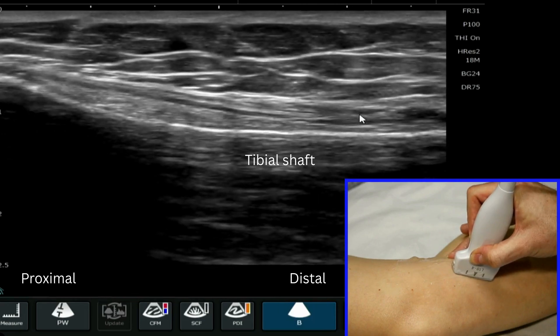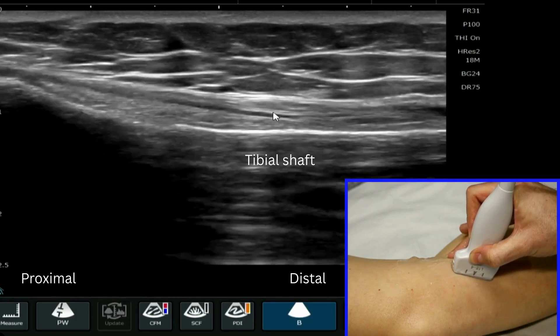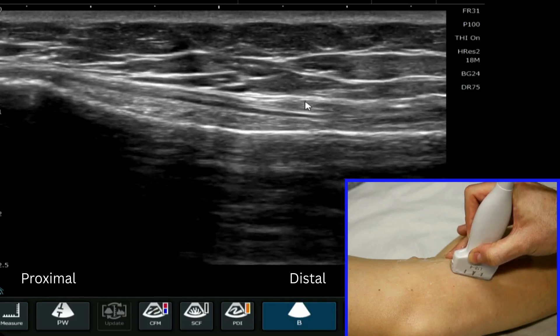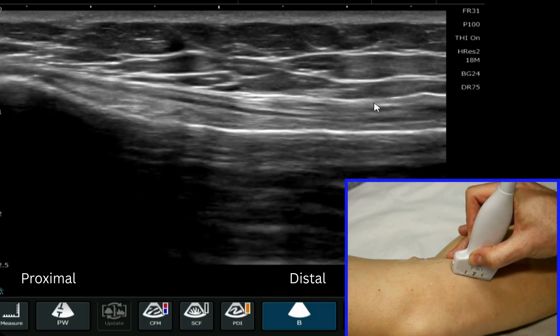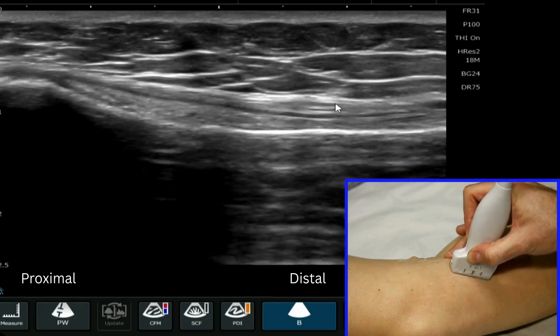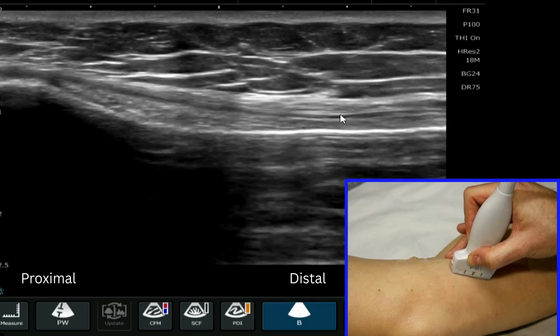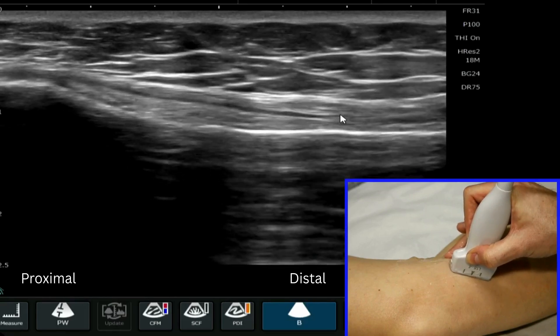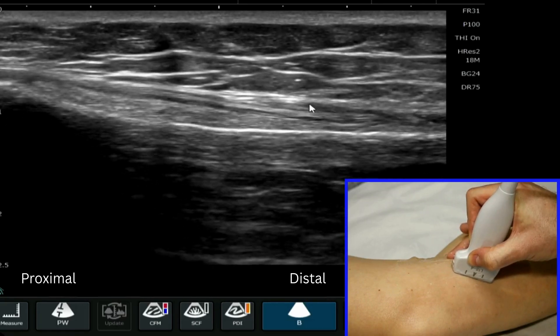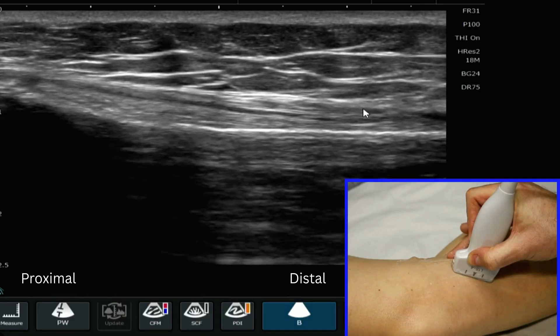Just above the distal aspect of the medial collateral ligament we can see — and if I tilt my probe we're just getting a little bit of anisotropy — these are the tendons. We can't actually make out the different portions of the tendons, but we can see these little bumps sitting above the distal insertion of the medial collateral ligament. These are the pes anserinus tendons.